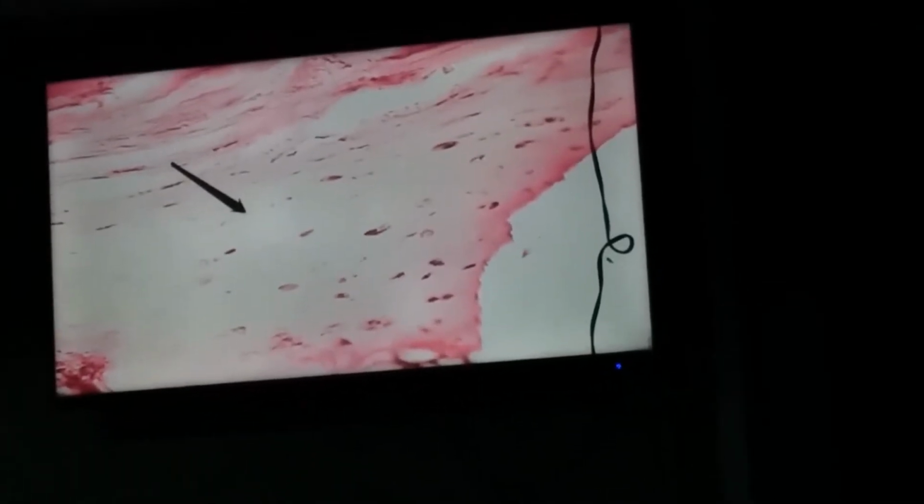area. Okay? So this one is the trabeculae. Right? Trabeculae. That's the big structure. Spongy bone, if we ask you, usually this is the structure that we will focus on. There are a lot of bone cells to be studied for today.